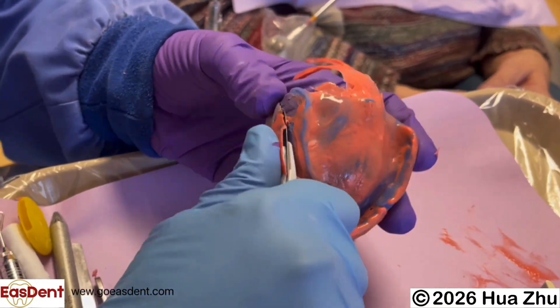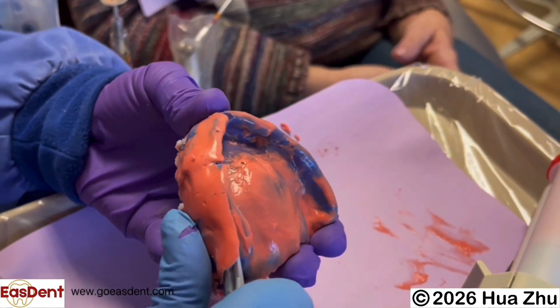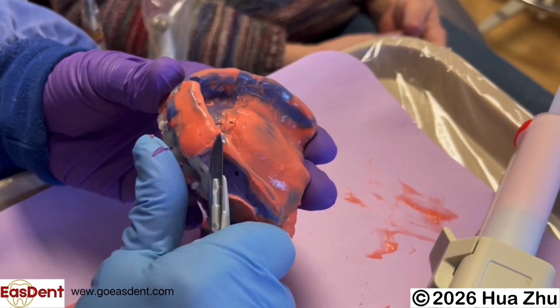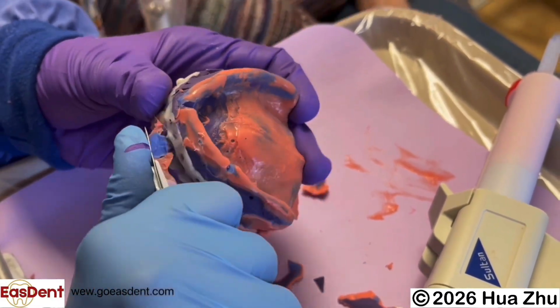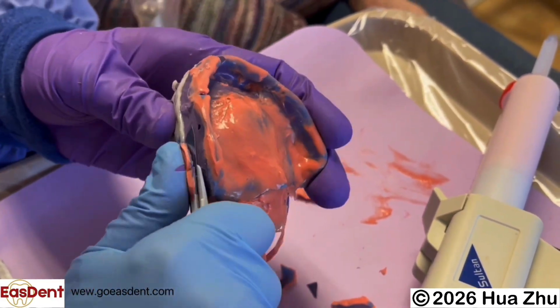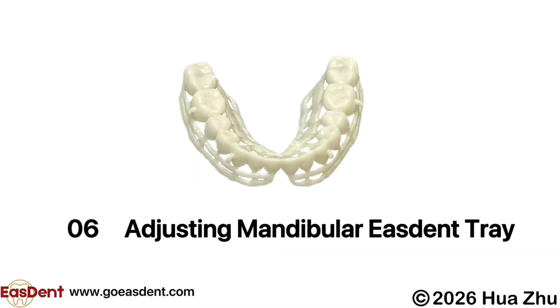When you do your final evaluation of the aesthetic and the function of the Easdent impression, the closer the shape of the impression to the shape of the dentures, the better chance the Easdent final impression can function as a try-in. Adjusting mandibular Easdent tray.